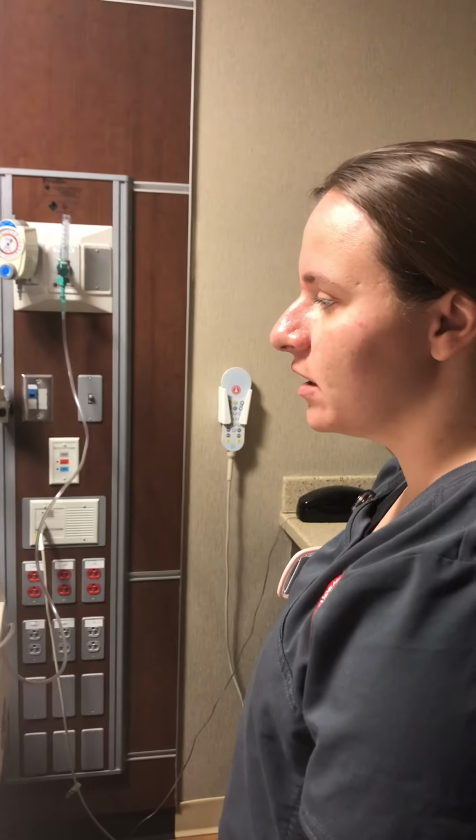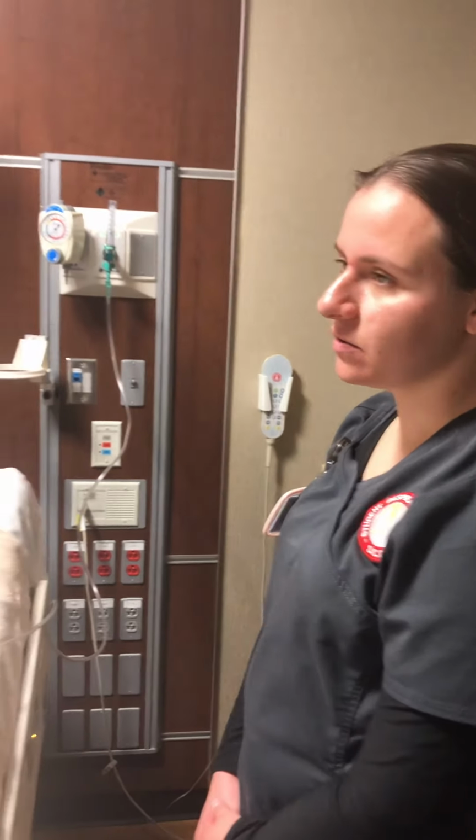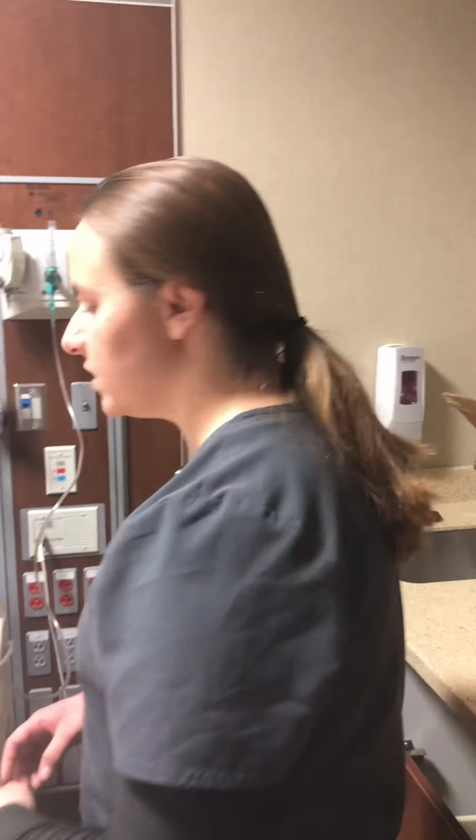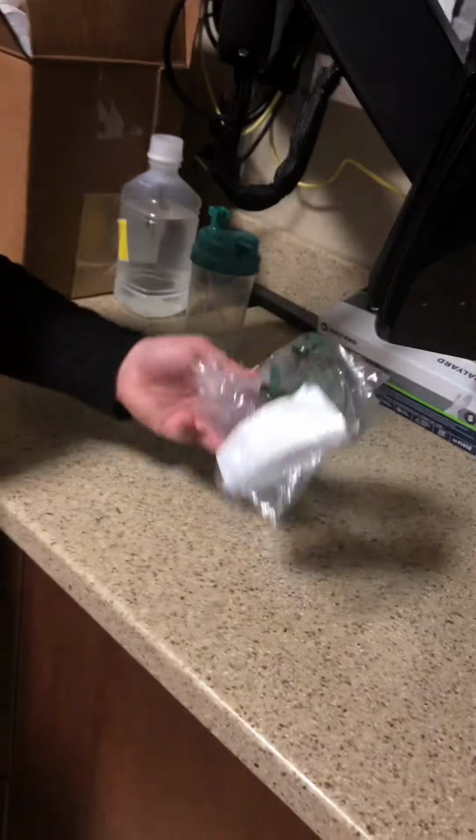They had been placed on a simple mask, so after I wash my hands and everything, I'm going to change the device to a face tent since they had a nasal surgery, and then I'm going to apply a humidity device to keep it cool and keep it humidified so that way it helps from any nosebleeds from the nasal surgery. So the first thing I'm going to do is I have a face tent here.